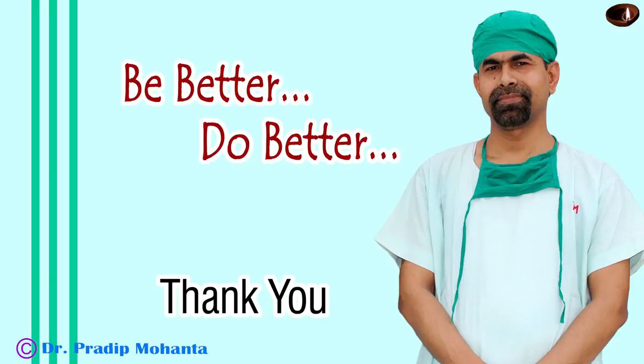Thank you very much for your attention. Hope this video will help you in developing your surgical skills. Be a great surgeon and serve your patients with love, respect, empathy, and great surgical competence. A routine case like this should not take more than six minutes. If it takes more than six minutes, it means we are spending a lot of time inside the eye, and that is not good for the corneal endothelium.